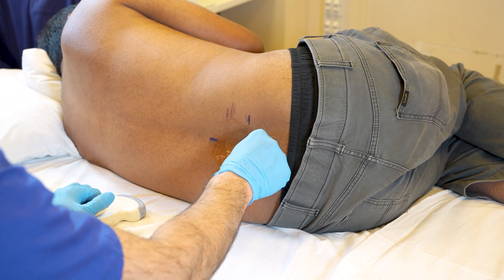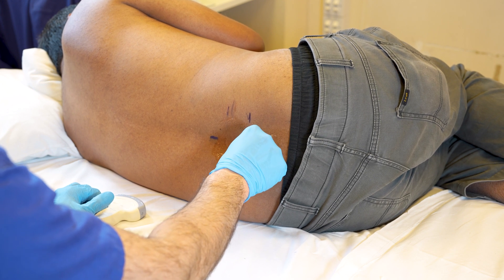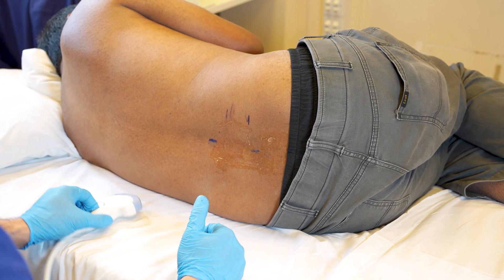We have identified two points of insertion. You can now clean the area and continue with the lumbar puncture procedure.